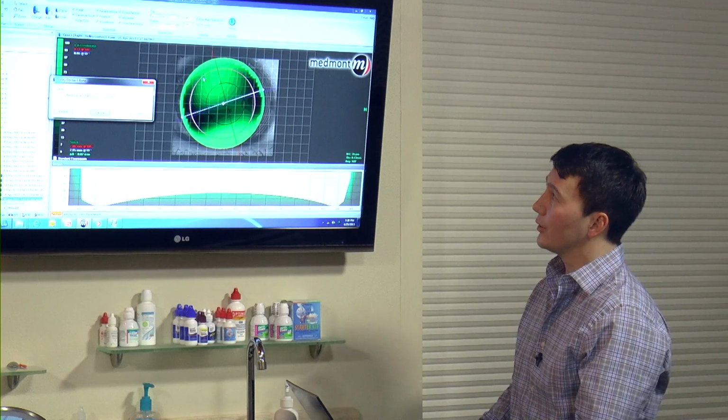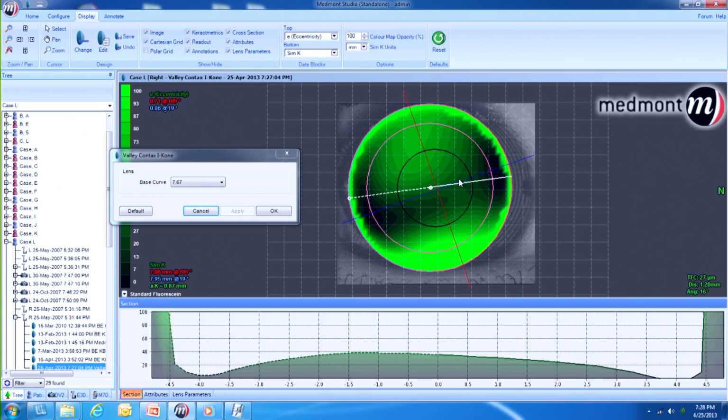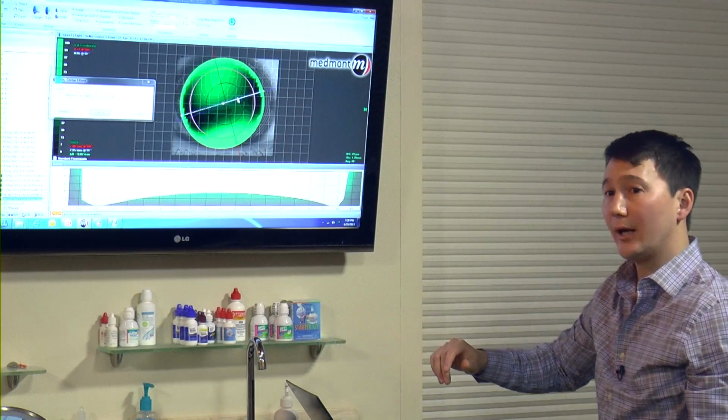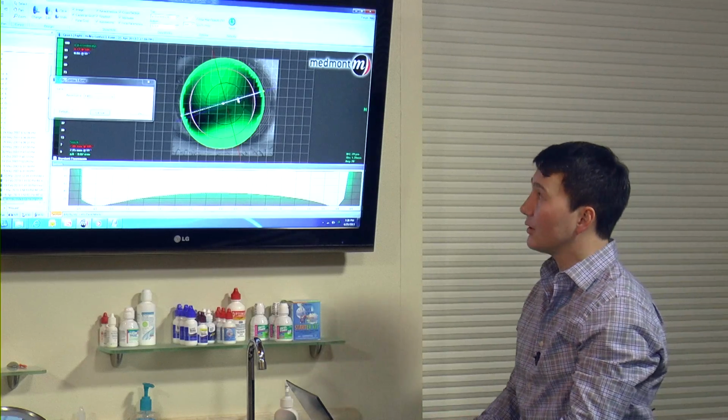Let's look at where the lens bears. So let's take this axis line around and look at the fluid underneath the lens. And it appears that it's going to land at 830 right here and at 230 right here. So this is good. Our lens will sit on the rails. It should be laterally stable, and therefore we should expect it to have hope of centering at least laterally.